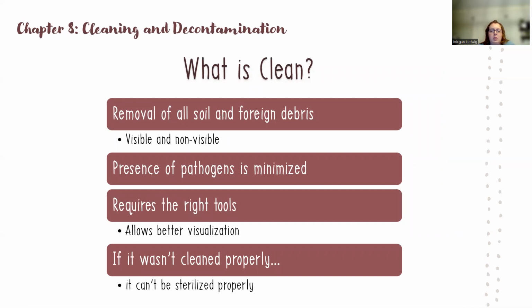Sterilization means that it has no microbes whatsoever, including spores. But clean, you're just removing the soil, the gross debris, the foreign debris that shouldn't be there from the instrument. That includes visible and non-visible things. So sometimes, yes, we can see that an item is bloody. We're not going to consider that clean, right? We are going to remove that.